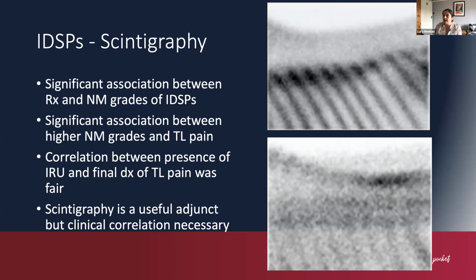The caveat to doing that, although it is a more scientific method of assessing these, is that it is actually relatively tricky to do after acquisition or away from the point of acquisition. Most scintigraphy systems have bespoke software that is specific to them, and any sort of post-processing manipulation has to be done with that software, which makes it more difficult to do that in a teleradiology situation.